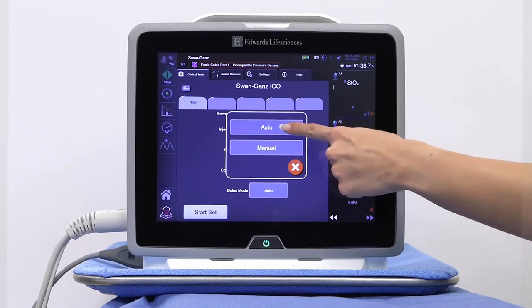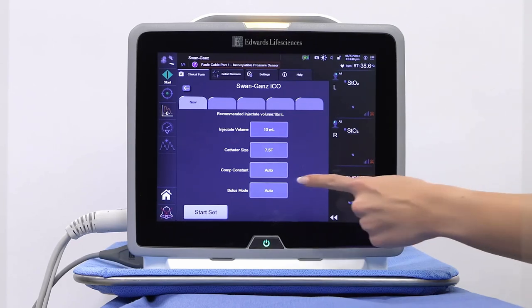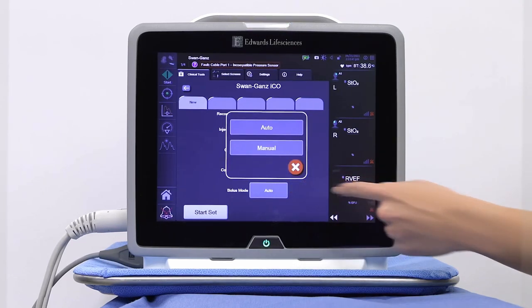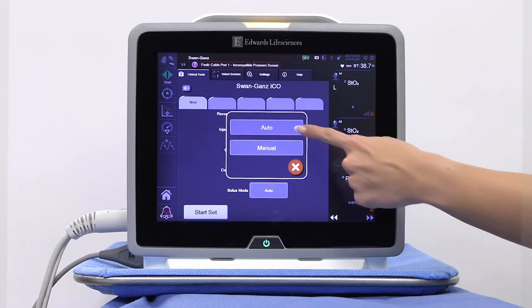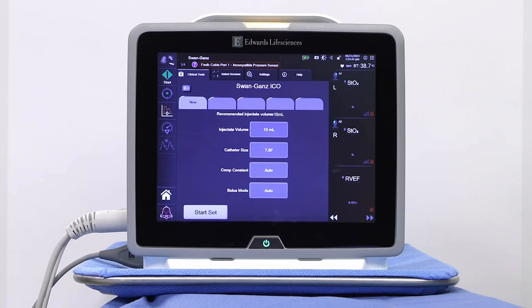Select the bolus mode. In auto mode, the Hemisphere Advanced Monitor will direct you when to inject the bolus. In manual mode, you can specify when the bolus injections occur.